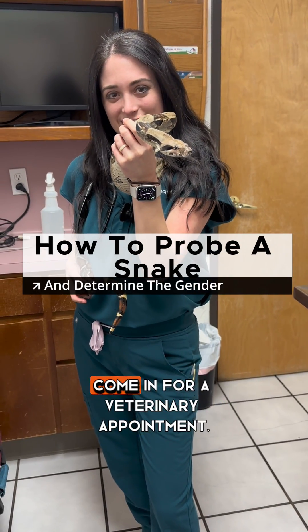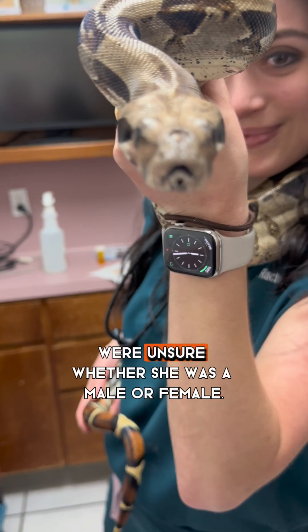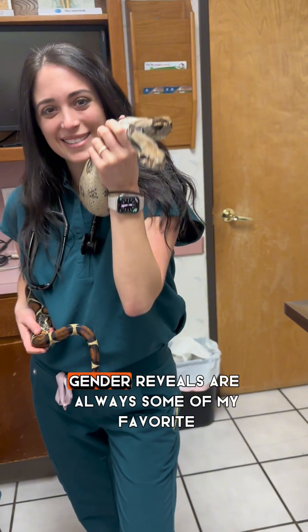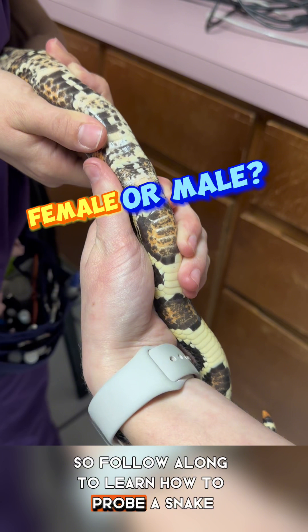Today I had one of the friendliest snakes come in for a veterinary appointment. Her name was Boanita, but the owners were unsure whether she was a male or female. Gender reveals are always some of my favorite appointments, so follow along to learn how to probe a snake and determine the gender.